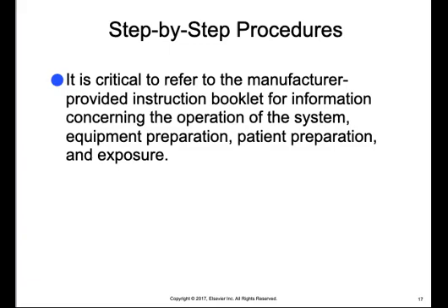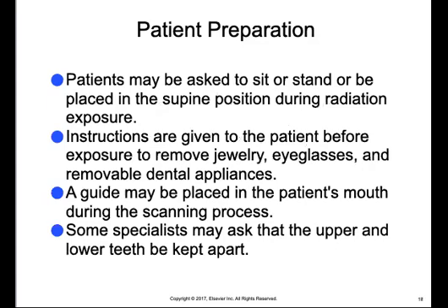Depending on the manufacturer guidelines, the patient may be asked to sit, stand, or be placed in a supine position, again depending on the type of model that you have. Then you'll instruct the patient to remove jewelry, eyeglasses, any removable dental appliances, or anything else that's metal in the patient's face or mouth area.